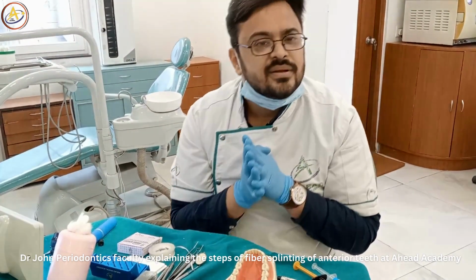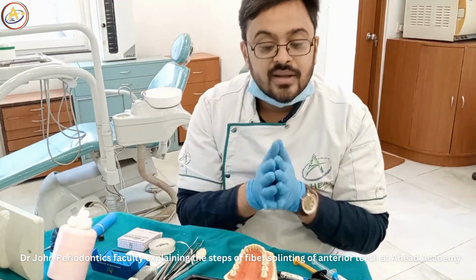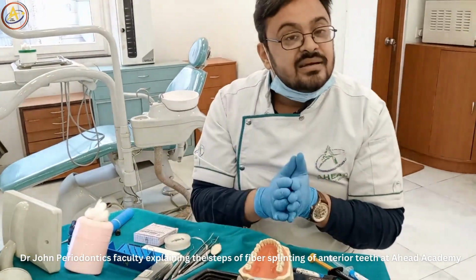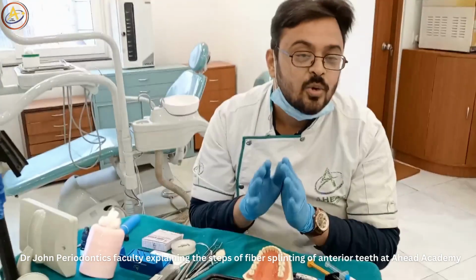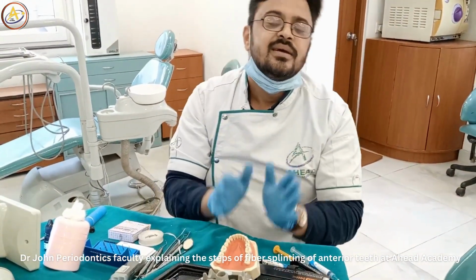Okay, so I hope this video might give you some insight into what splinting is and what materials are required. Every week we'll bring one video enlightening you on all the treatments which are done here, under proper faculty supervision, and they are done directly on patients. There are no dummies here. Typodont is only for demo purposes. We do it directly on the patient.